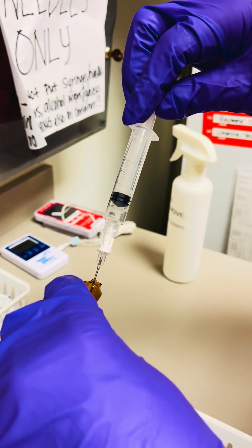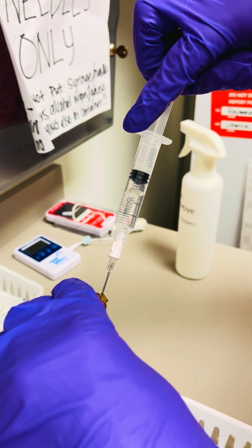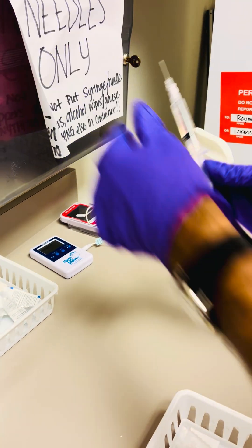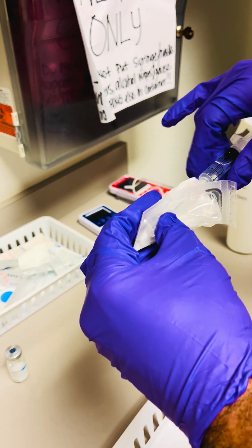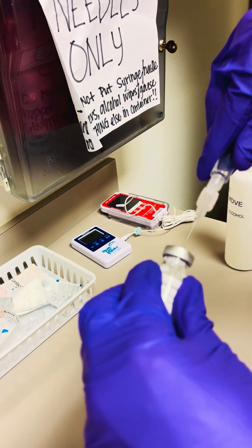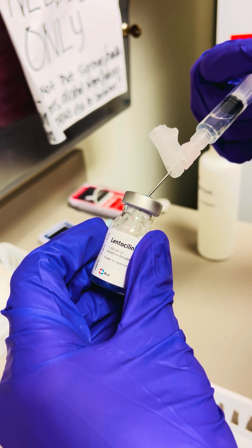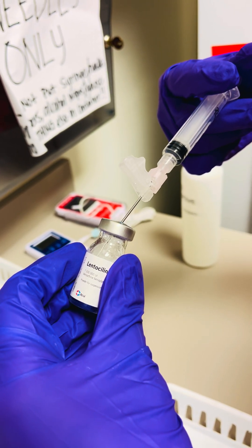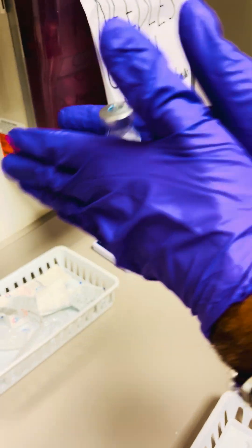Using the filter handle, attach an 18 gauge needle and then dispense the entire contents into the lyophilized vial. Dispense the liquid onto the wall of the vial and then gently reconstitute the powder.